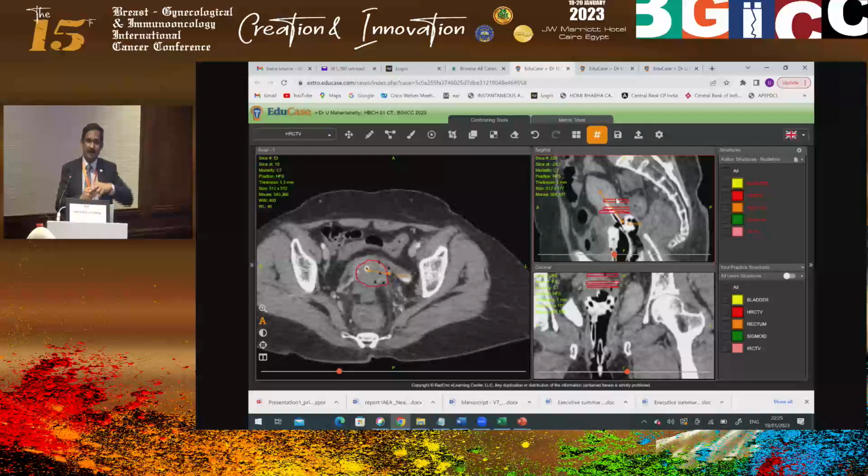Second most important point when you are planning is, even in MR image guided adaptive brachytherapy, we are not very conservative when it comes to tandem loading. We don't reduce the tandem loading too much. So we still continue with standard loading. So having said that, your isodoses will be always here, right? So it will never reduce your doses. So that is why it is okay if you make it lower 2/3. Is that clear? When you don't have MRI information.